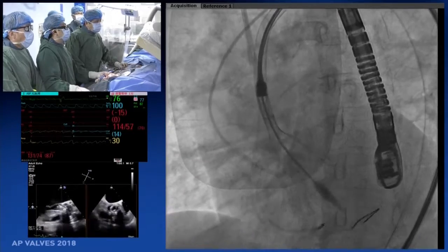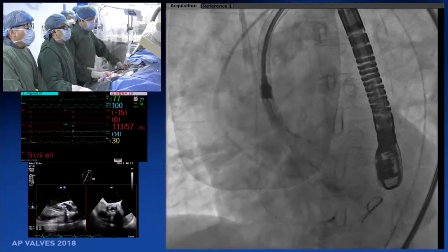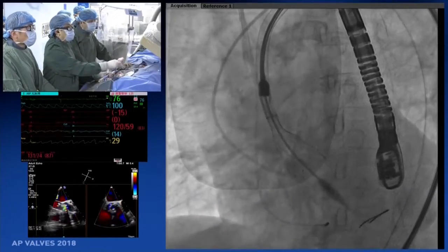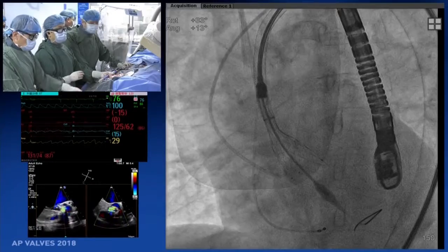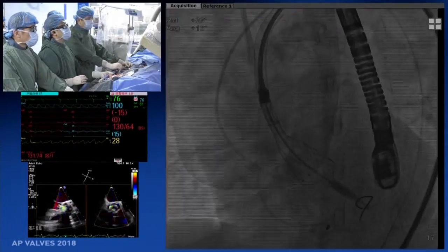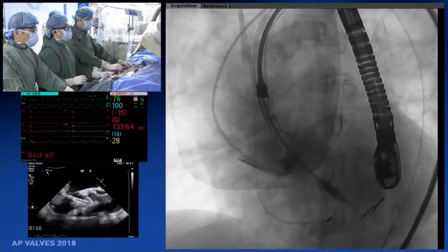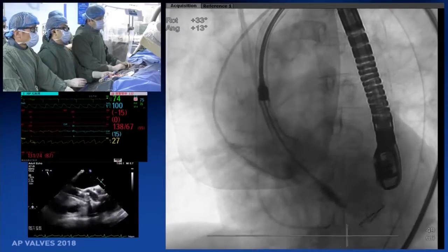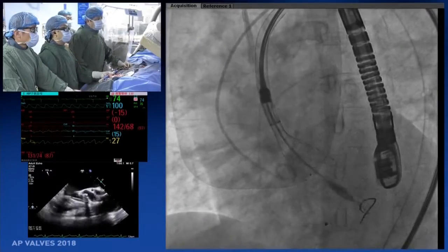What is your idea until now? What is your idea for what we have done? I would do an angiogram. So far, I'm not sure. Seems to be very deep. Do the left coronary side angiogram. Okay. Can you see it with the TEE? Do you see how far it is? No, it's not too bad. Not that bad. But the angle is not good, huh? It's a regular phenomenon. I think it's okay.